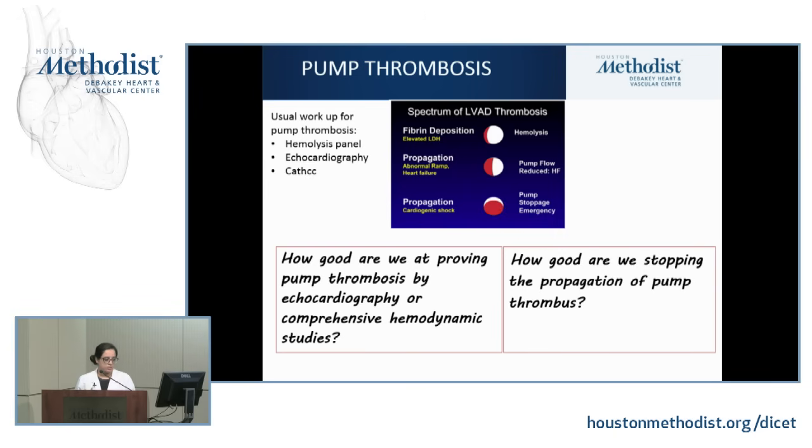So my two questions to myself have been, how good are we at proving pump thrombosis by echocardiography or by comprehensive hemodynamic studies? Not very good. We're not able to discriminate. And to be honest, if somebody is completely clotting off their pump, I can tell you at the bedside.